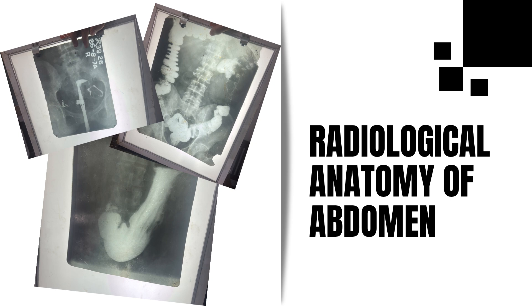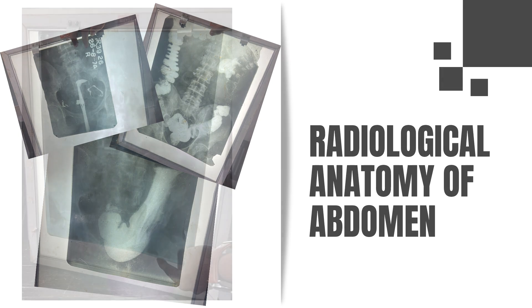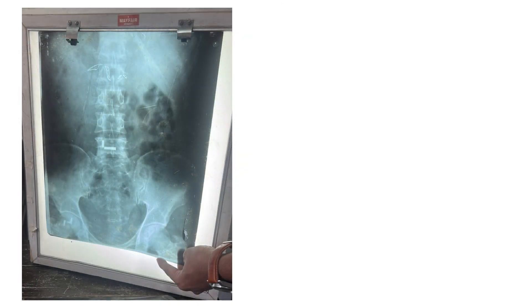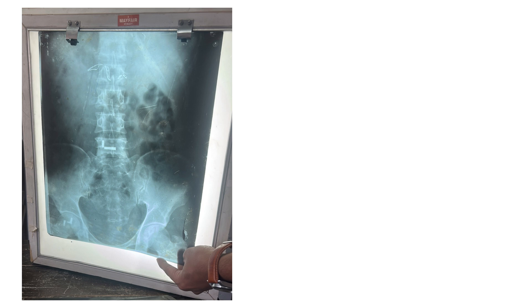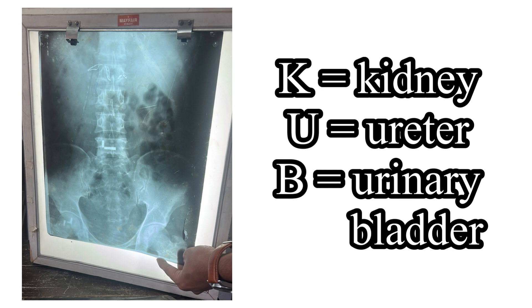Radiological anatomy of the abdomen. This is the X-ray KUB, which is also known as the plain X-ray of the abdomen, since no special dye is used for imaging. KUB stands for kidney, ureter, and urinary bladder.